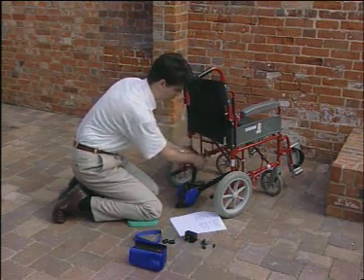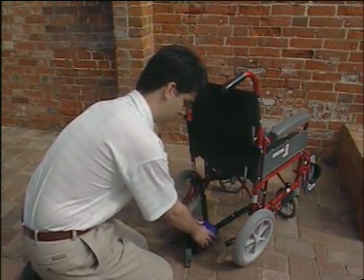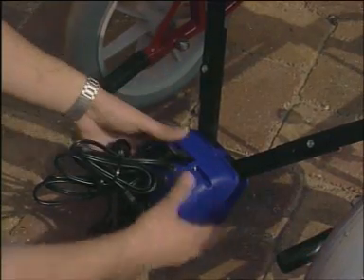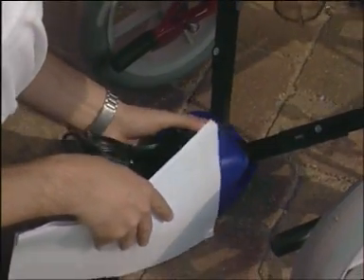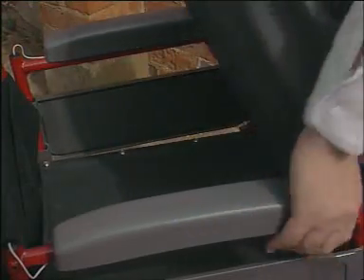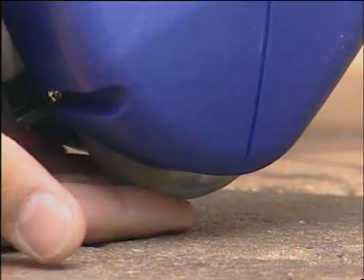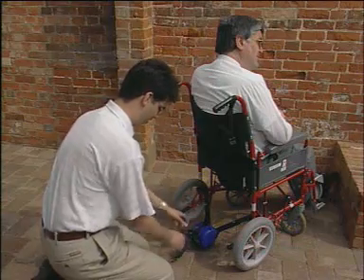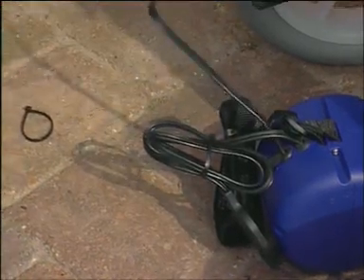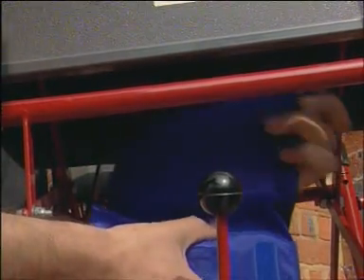The correct alignment of the drive wheel is crucial — simple but very important. Line up the drive wheel so that it is equidistant from the two wheels, with the groove in the side of the case vertical. When it's positioned correctly, tighten up the two arm clamps securely. Prior to adjusting the strap length, help the user into the chair, then adjust the drive wheel so that it is one quarter of an inch off the ground — if you do this earlier, the user's weight will lower it back down. Finally, snap the switch onto the handlebar. The Sinclair WDU-assisted chair is almost ready to go.